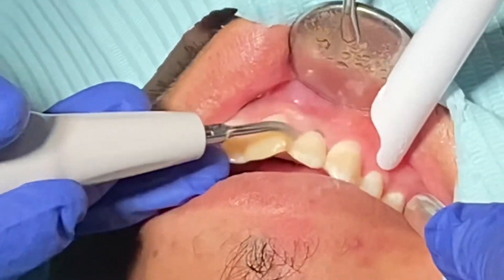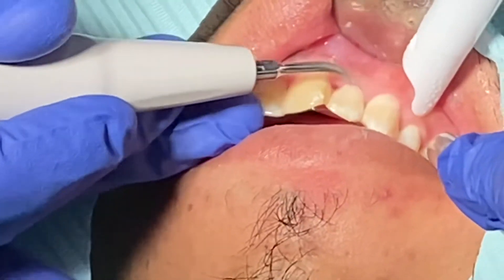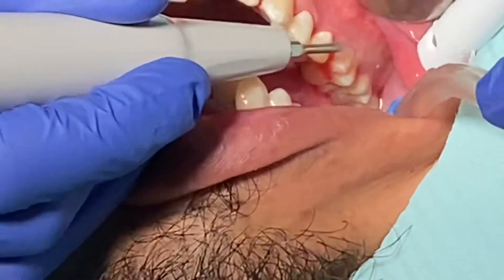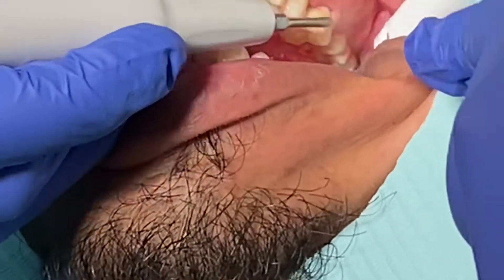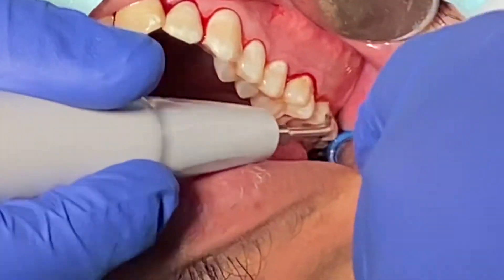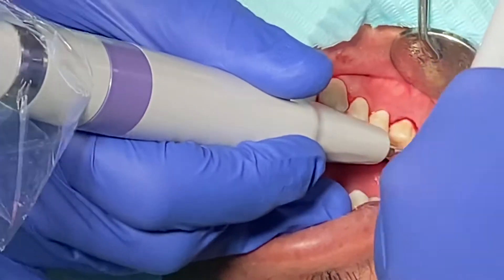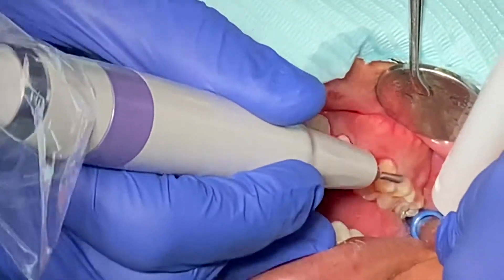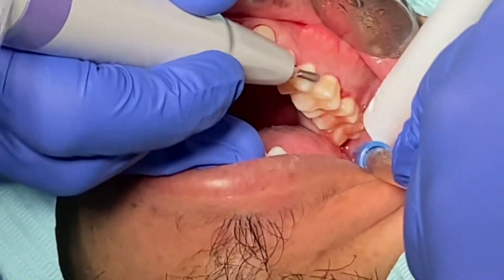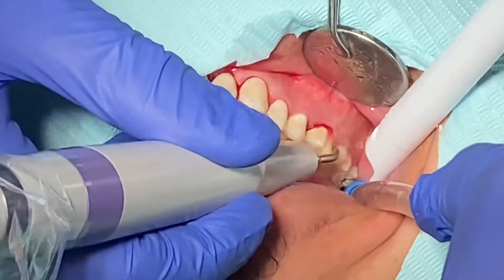Right now we're looking at a few teeth on the upper left side, and you can see there is a lot of calculus and tartar coming out. On the next couple of teeth you don't see as much calculus there. But when you do the cleaning and see a lot of blood coming out, that's because of a very small layer of calculus stuck down under the gum. On tooth number 14 — the molar — there is a lot of white calculus under the gum, meaning food has been trapped there for quite some time. The front side has black calculus and the back side has white calculus. Calculus comes in different colors depending on the food you eat.